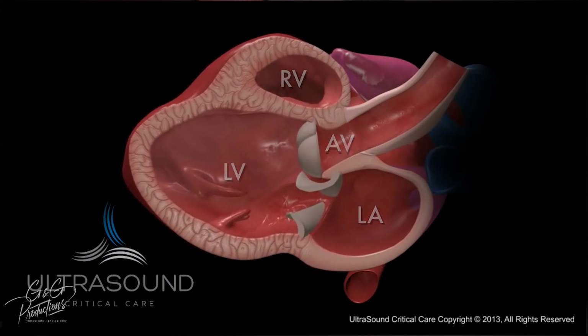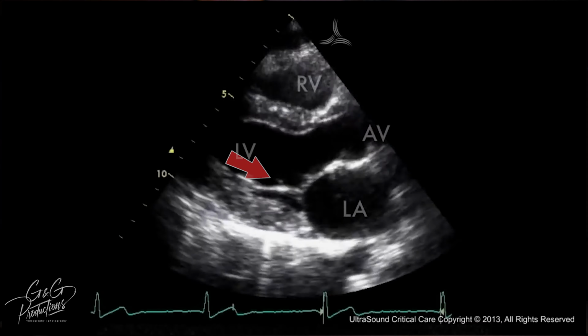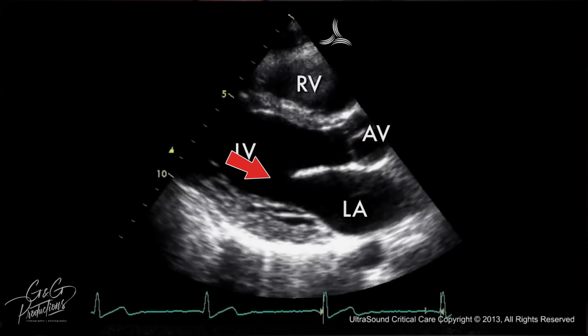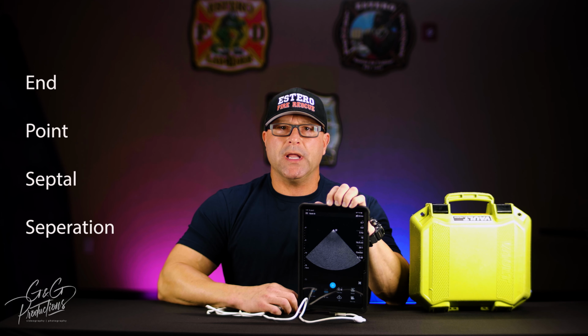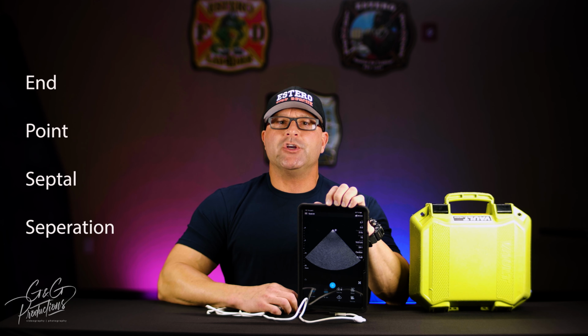Now, if we put that image into motion, it would look something like this. You'll notice on the bottom of the screen around the center, right? You can clearly see that the mitral valve is flapping. This is a good wide flapping of the mitral valve. It's known as EPSS, or E-point septal separation. And it shows the mitral valve slapping the septum of the heart. And that's a very good sign that the heart is very strong and working how it's supposed to. If you see a mitral valve that's barely opening, barely slapping that septum, that's a trouble. That's a heart that's failing, and that patient's going to be in trouble. So just be aware of that.